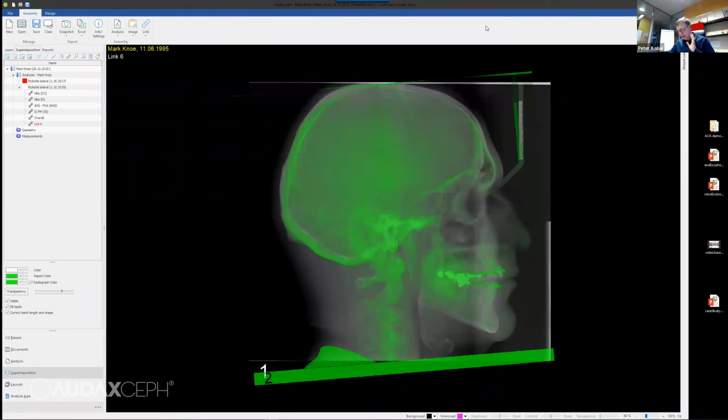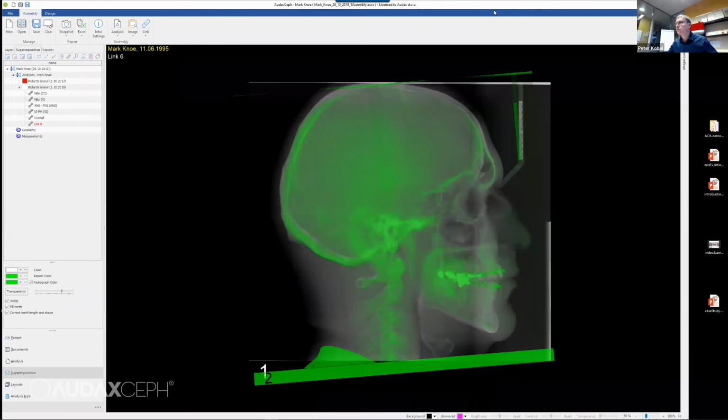So one thing, we are not finished yet. Maya will continue, and then we also have questions and answers, although you may want to place them whenever during the webinar. But here are the polls. So I wonder if you could answer some simple questions. So I will launch it for you, and you can see that. So I wonder if you could answer that.